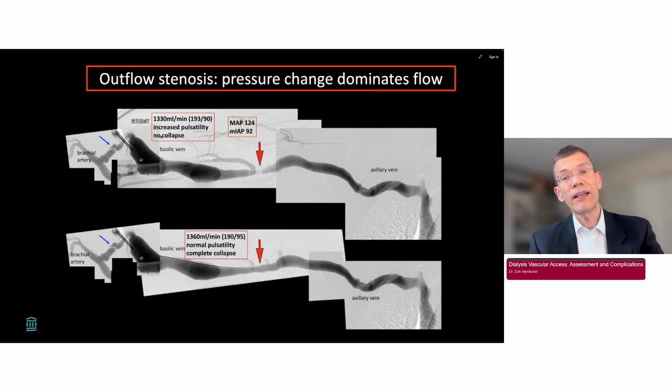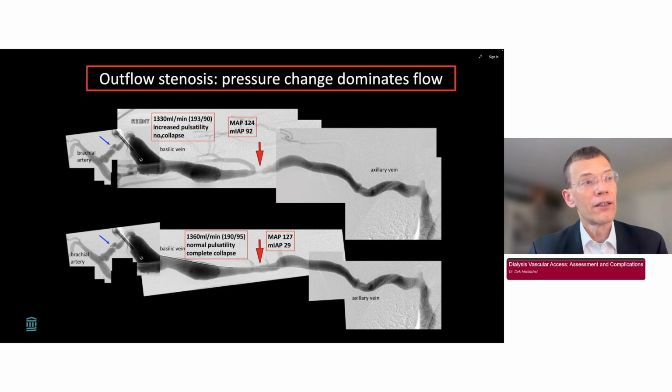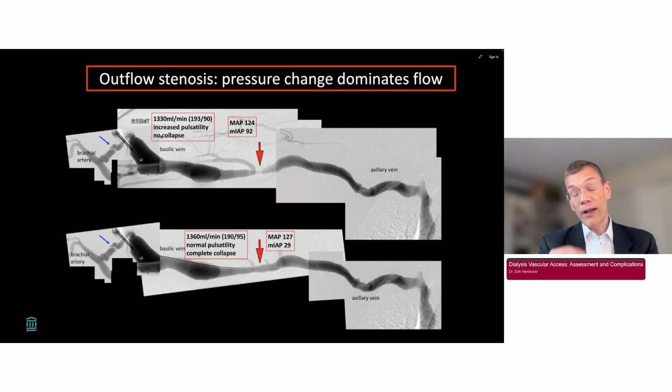There is a flow regulating inflow stenosis that, depending on what the blood pressure is, only allows for minimal increase in flow, and most of the time the flow is about a liter or 1.3 liters because the artery is pretty large. At the same time, though, with the access open, the intra-access pressure goes down into that range, 25 to 35 millimeters of mercury, that is associated with very little enlargement of aneurysms. And so in the end, we place a stent graft across this for long-term patency, and with that amount of flow, these stent grafts can be very, very effective.